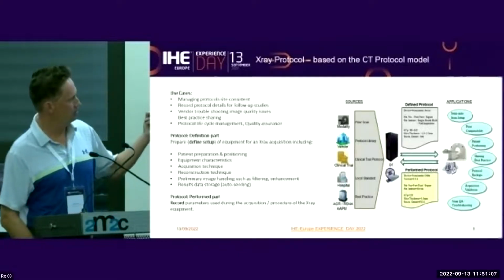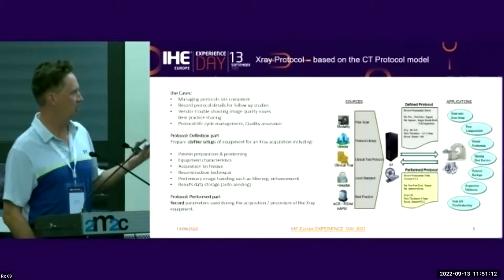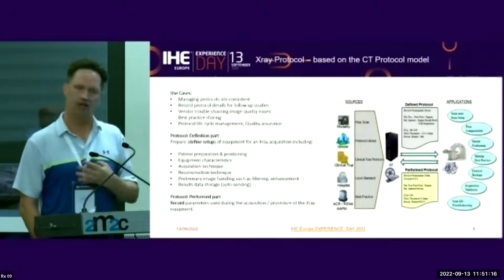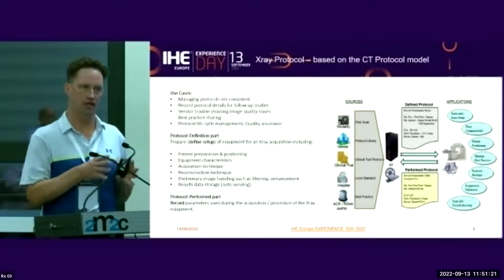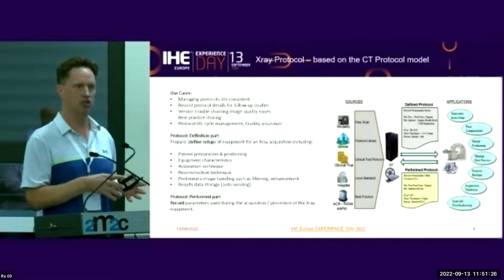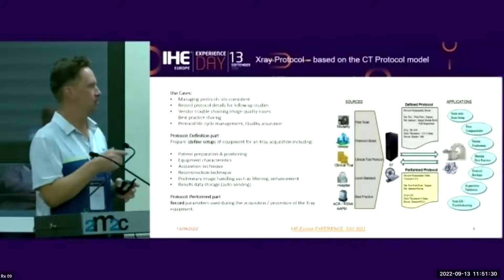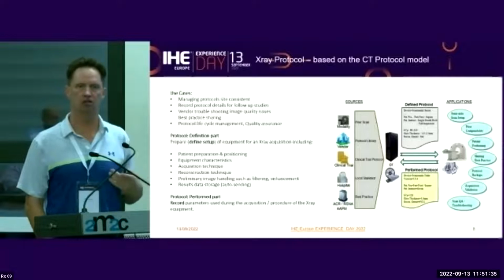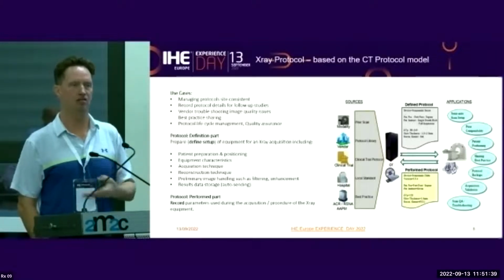And for X-ray, you need to set up the equipment. You need to decide what acquisition technique is going to be used, what reconstruction technique is going to be used, and all things. And these are equipment specific. So if you have from one vendor a specific X-ray machine, you would have one protocol for that type of machine. And these protocols are really good because you have sort of a definition part where you define how this protocol should be done for this study.